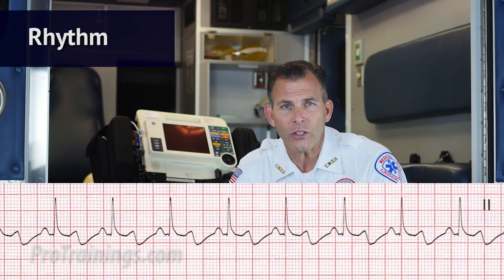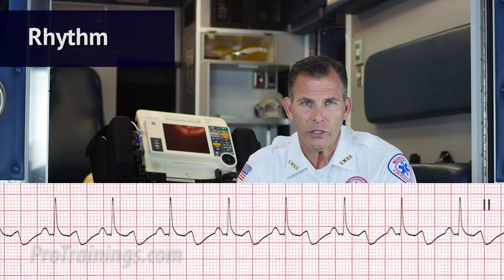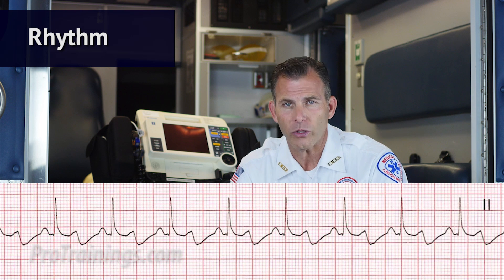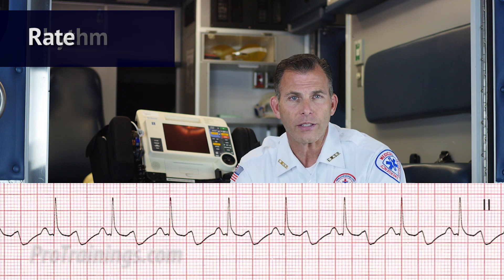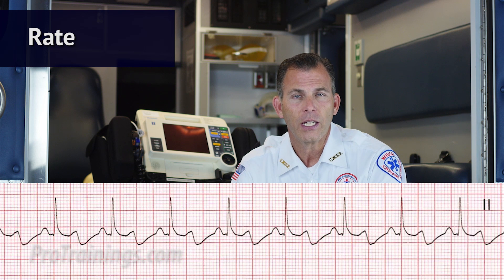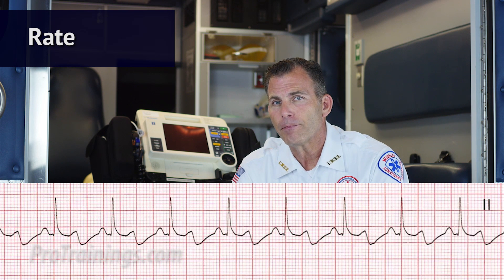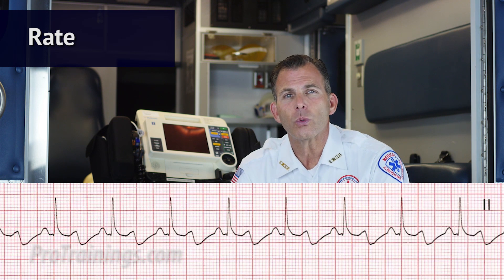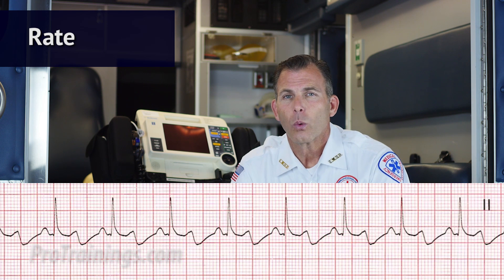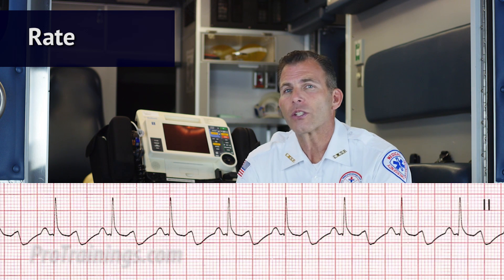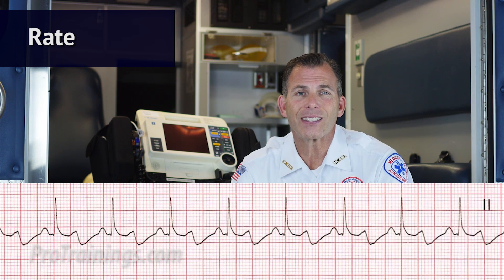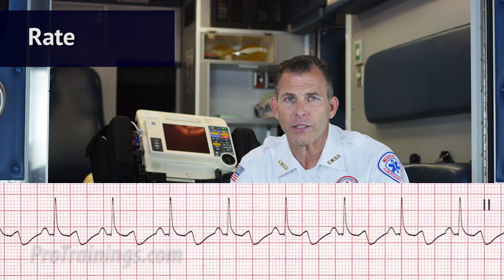So we're going to start with the rhythm. Is the rhythm regular or irregular? In this case it's regular. Next we look at the rate. What is the rate? It's 80 beats per minute. Is the rate normal, fast, or slow? We know that the rate is normal because the rate is between 60 and 100 beats per minute.